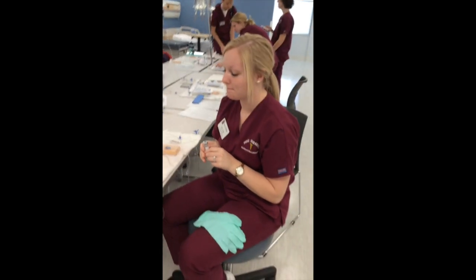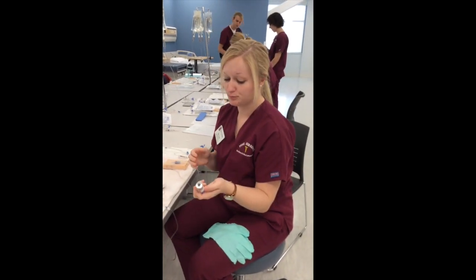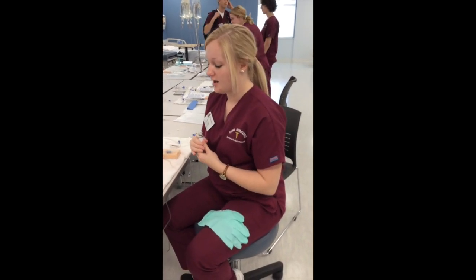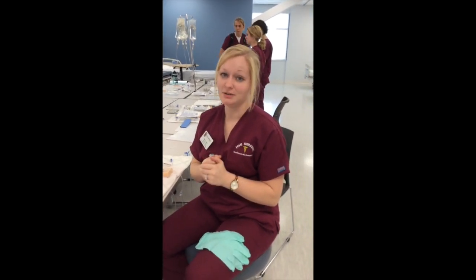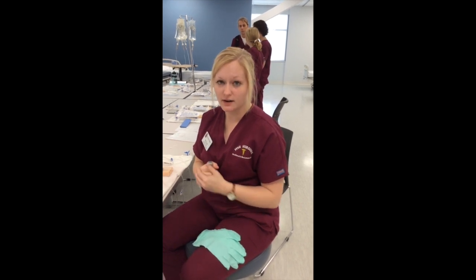So then I've done all that, I am going to prepare to go into the room and administer the medication. So, knock, knock, knock. Hi, my name is Dusty. I'm going to be a student nurse today. Can I get your name and date of birth? Thank you. Do you have any allergies that I need to be aware of?